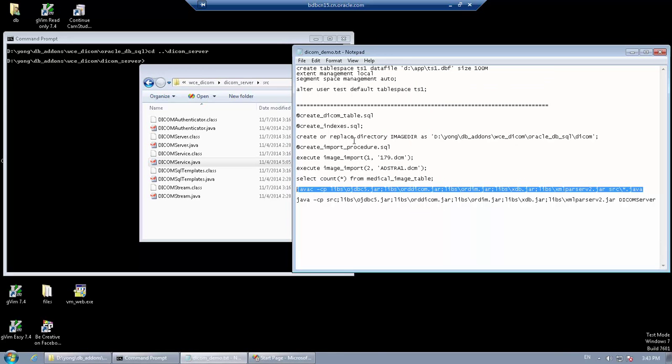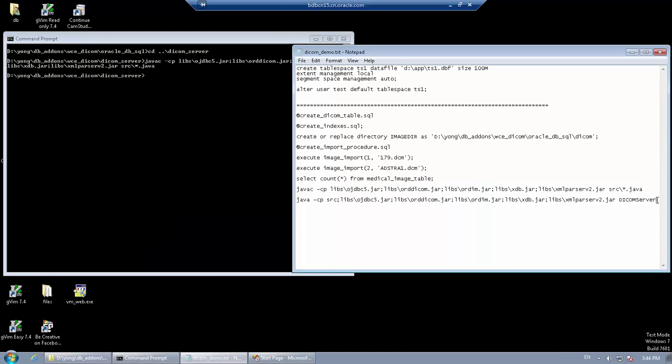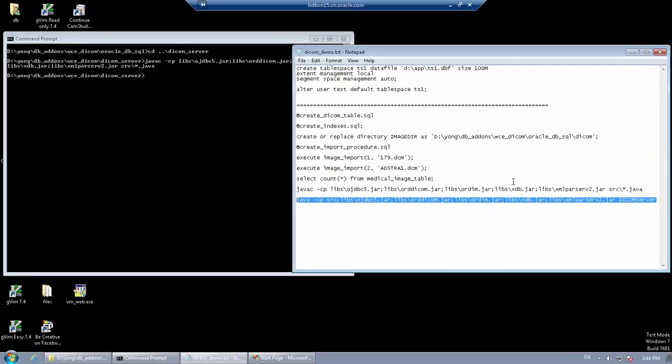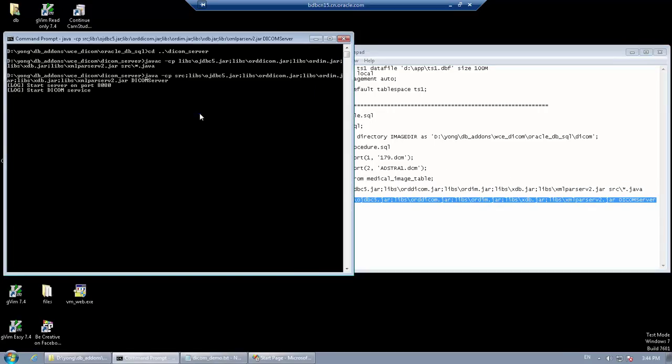Now we compile and start the server. The server is now started on port 8080.